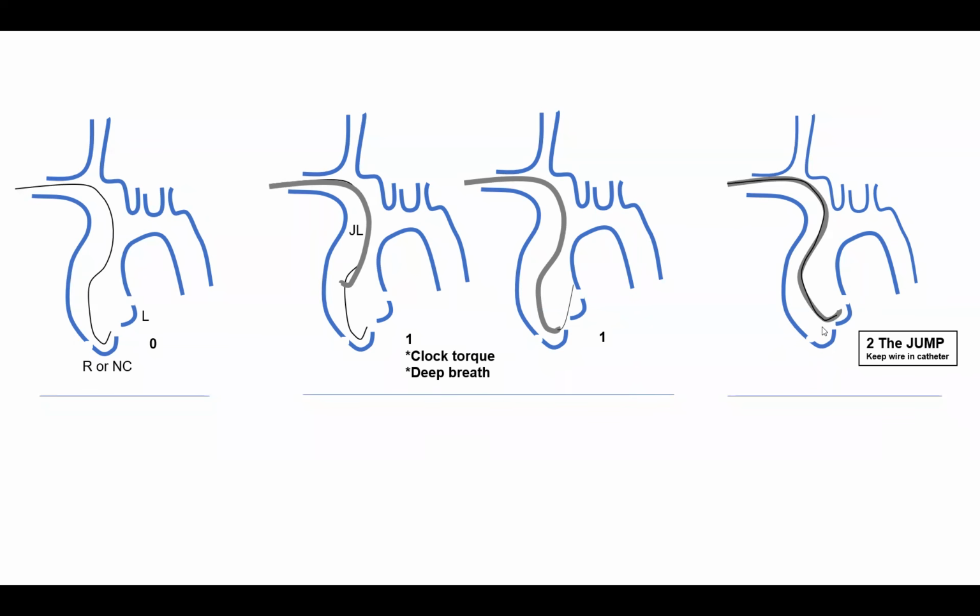Now, there is an issue: sometimes as you're pulling to make it jump, the catheter jumps all the way out, or the catheter flips out on itself. As you're trying to pull from here to here, the catheter flips out on itself and embraces its natural tendency. Okay, so you need to be ready as you're pulling, you need to be proactive. And if you see the catheter starting to prolapse out, you need to immediately reverse and do some torque, as I will show in a little bit.